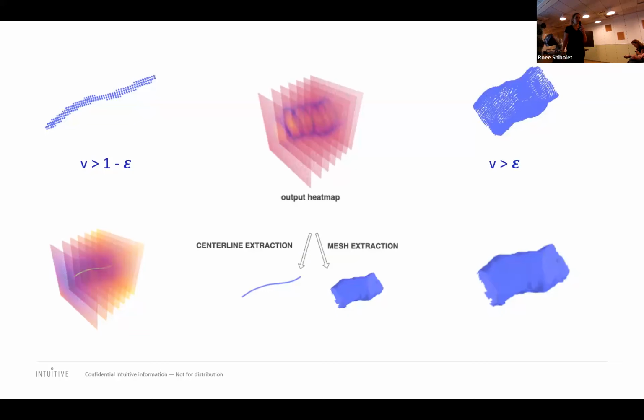So once you have the CT scan, you have an option to identify different types of tissue in it. The thing is that what we cared about is to have something that looks like the output of SLAM. The assumption is we don't have a CT scan. We have the output of the SLAM algorithm, and so we wanted to have a training set of shapes that look like colons. So all the information that we can get from the CT scan is information that we don't assume we will have when we run SLAM on a colonoscopy video.